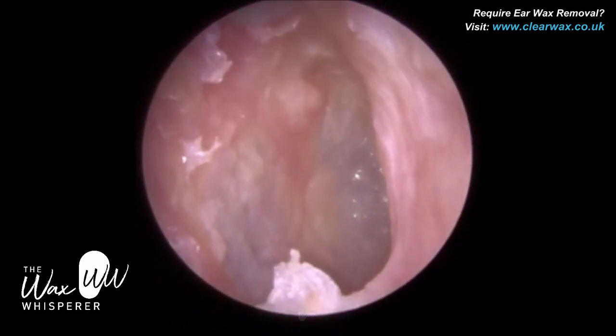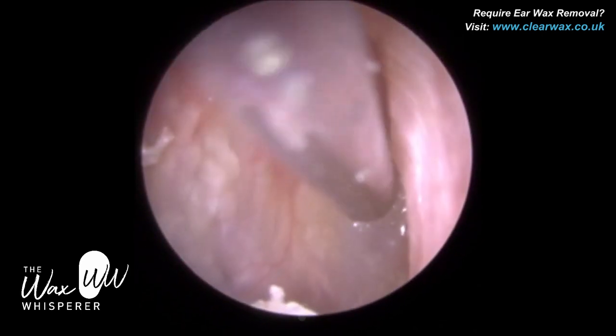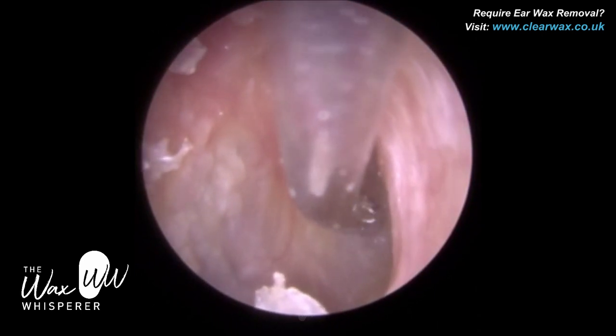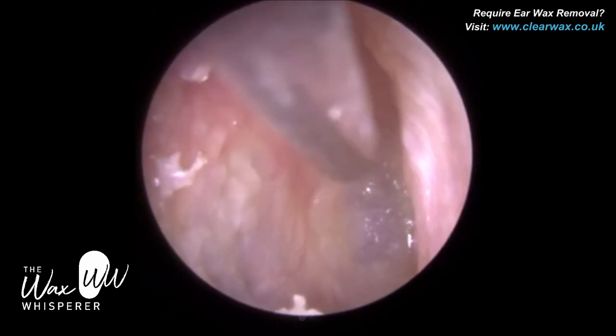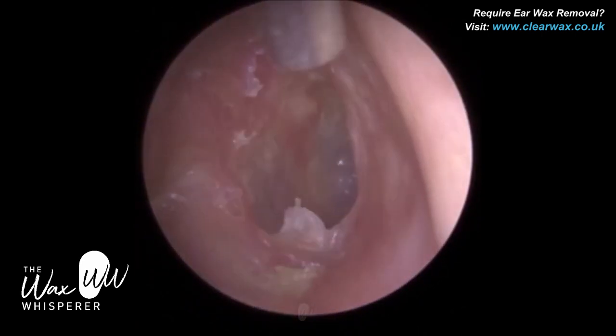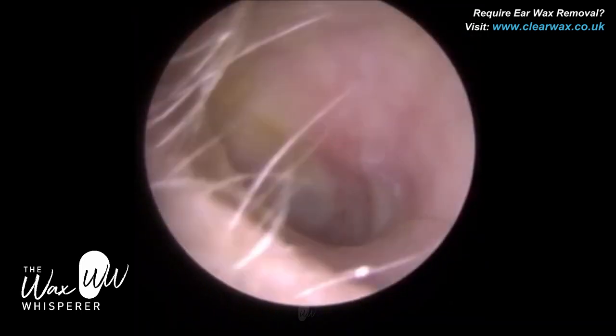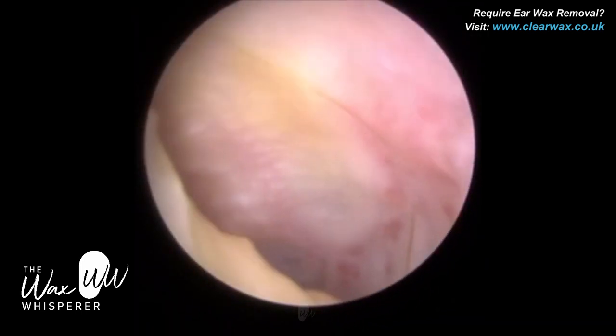We're not going to remove every last bit of dead skin — we just have to wait for some of it to naturally shed. But you can see the eardrum now; it's a lot more apparent. It was almost camouflaged before by the layer of dead skin. I'm quite happy with that — the patient can hear again now.